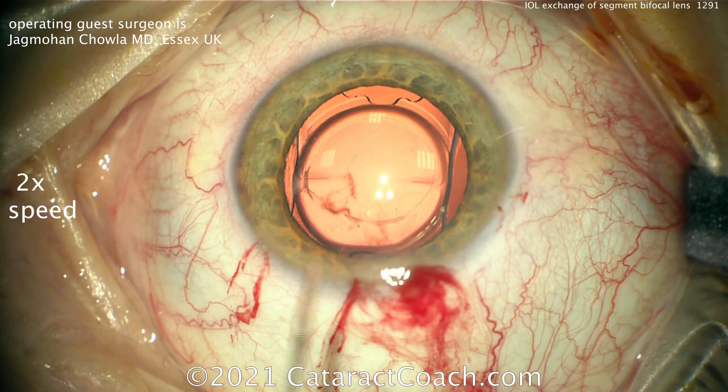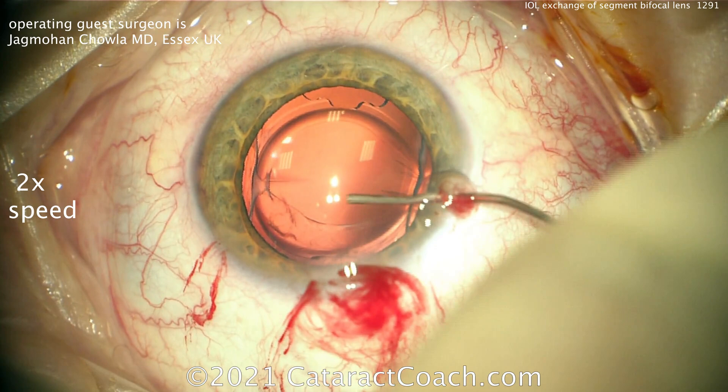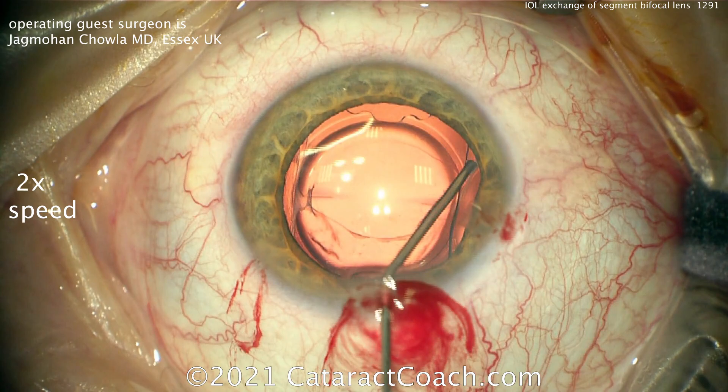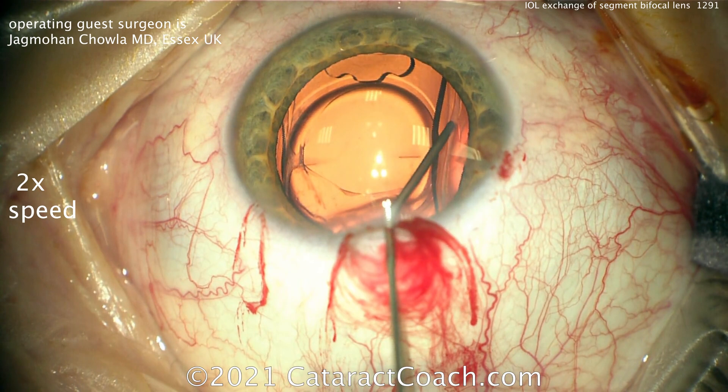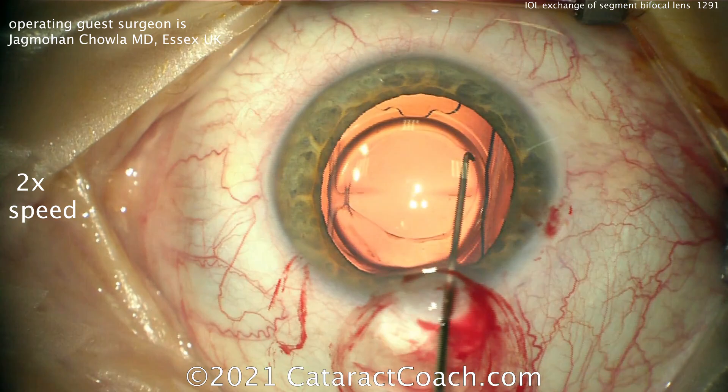Use a dispersive agent — a more liquidy agent — and inject it to really open up the capsular bag. Notice he's making use of those extra paracenteses to go 360 degrees and inject that viscoelastic. That's going to make all the difference to really open up the capsular bag. This is where most of the time is spent. Once that fluid wave of viscoelastic goes behind the optic, you know you're in a good position. Viscoelastic is cheaper than vitreous, so use plenty of it.